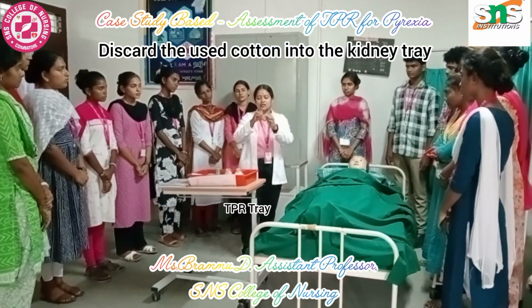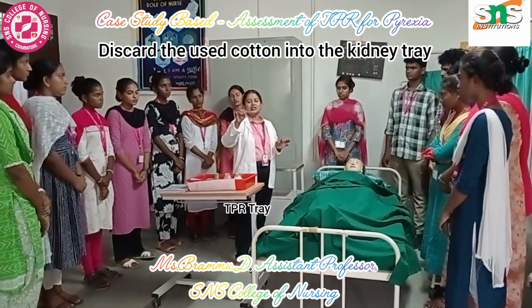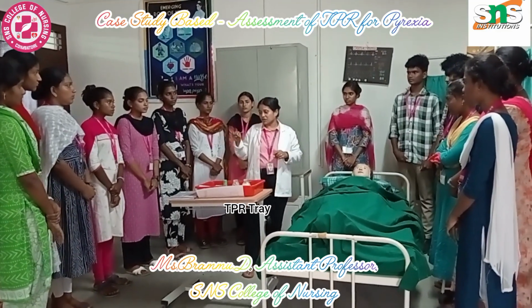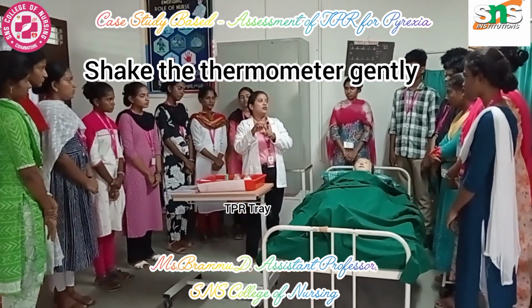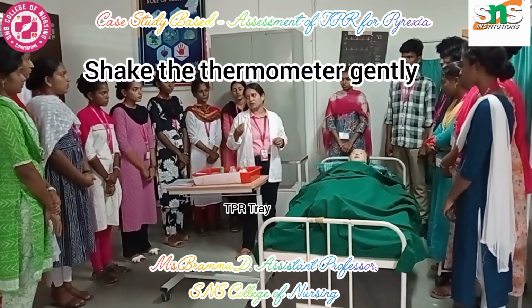After you have cleansed it, then you have to discard it into the kidney tray. And see that we have to shake the thermometer. Why are we shaking? Any idea? Because there is mercury in between and there is a constricted ring, so it should fall below the normal level. Then only we will identify whether the patient is having a temperature or not.